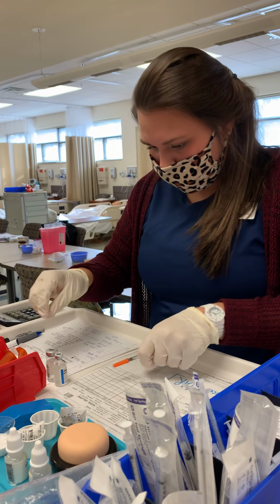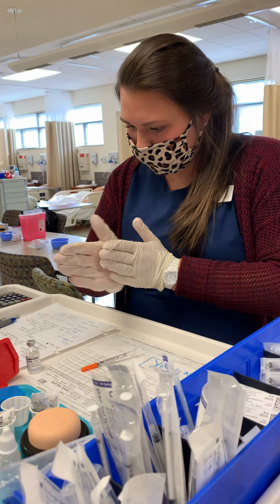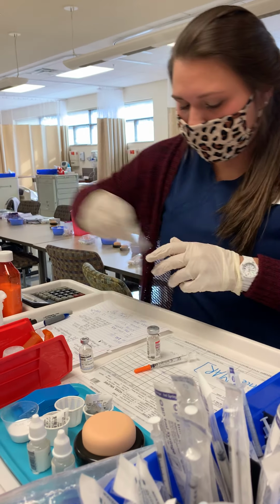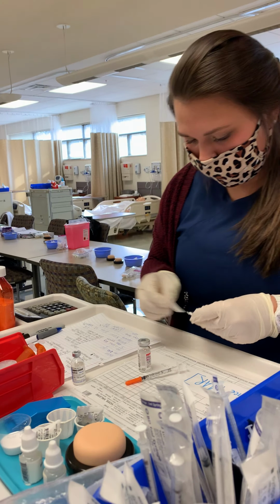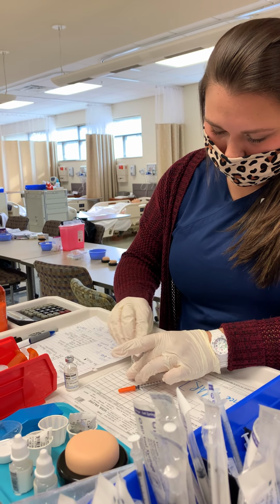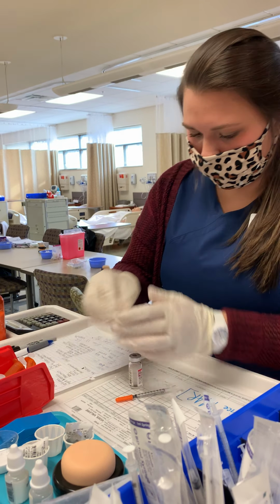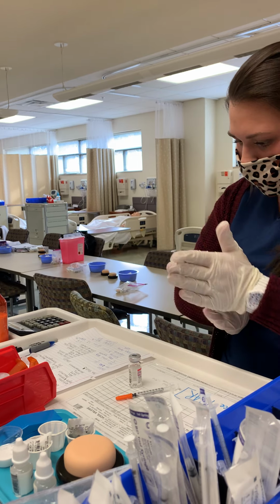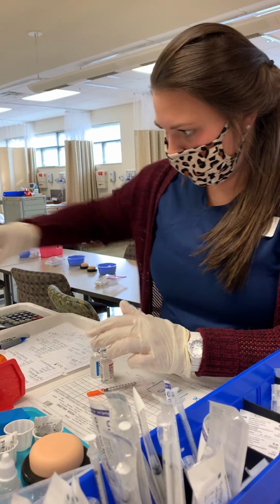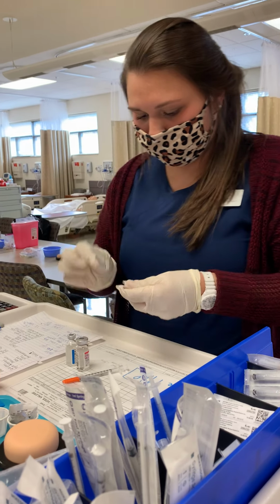All right, so I'm going to roll my regular insulin. I'm going to wipe it down for 5 seconds. I'm going to roll my NPH. I'm going to wipe that down for 5 seconds.